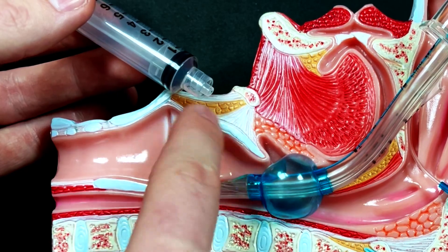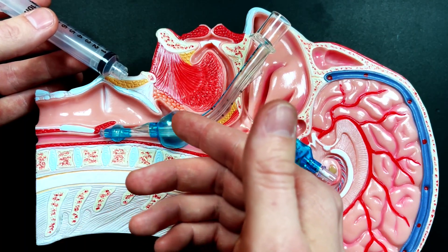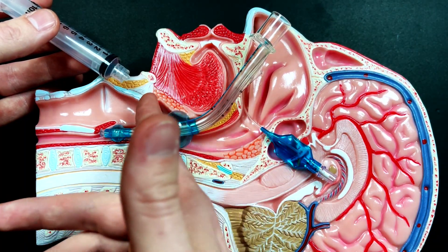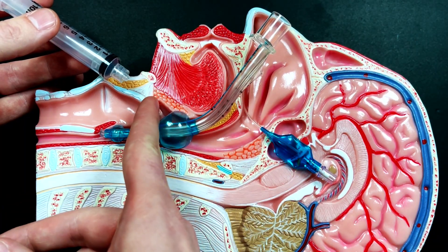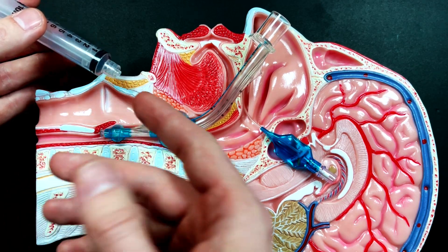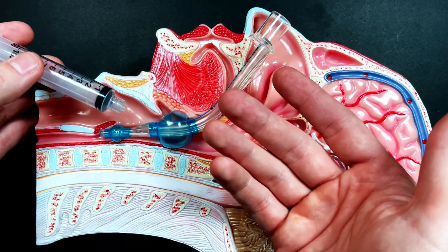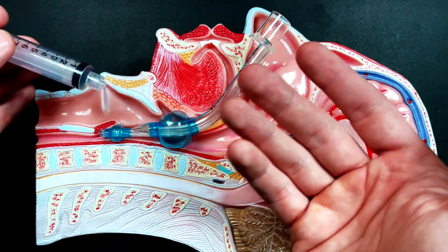This is the epiglottis, and probably what's going to happen is that the supraglottic airway is going to smush this epiglottis up against the glottic opening, and we won't have any way of ventilating the patient still.